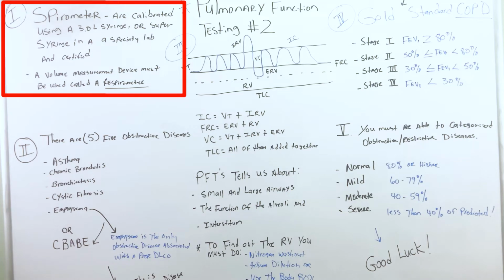A volume measurement device must be used called a respirometer. All of these devices have to be calibrated, and you will be asked about that on the TMC exam.